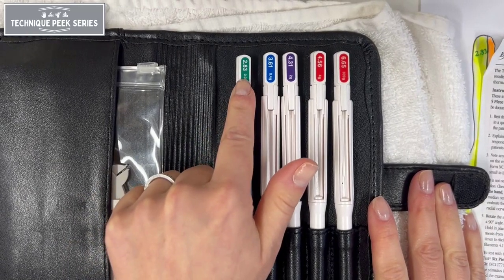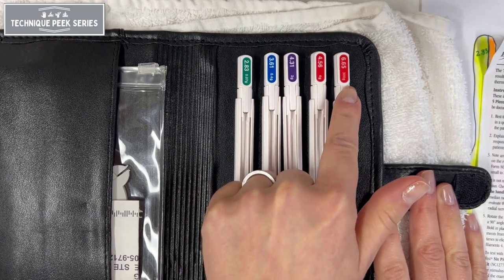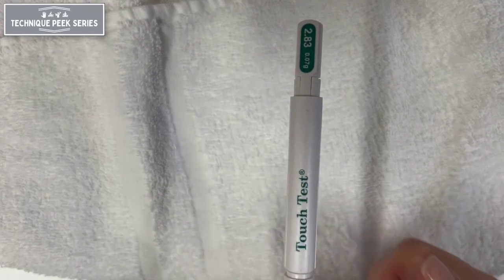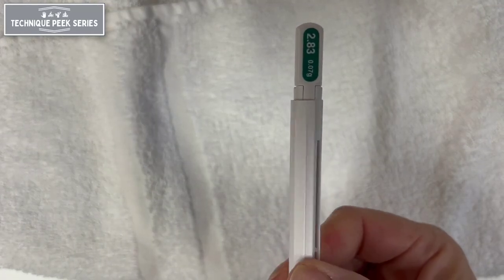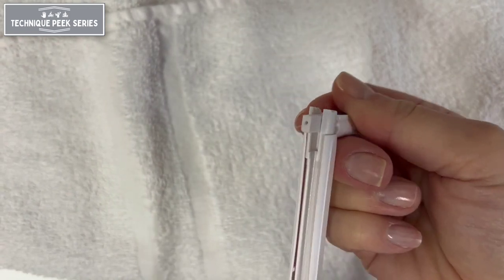The progression seen here is from the smallest diameter to the largest diameter monofilaments. The proper way to open each wand is to twist the plastic piece exposing the monofilament, then tilt the cap to a 90 degree angle.